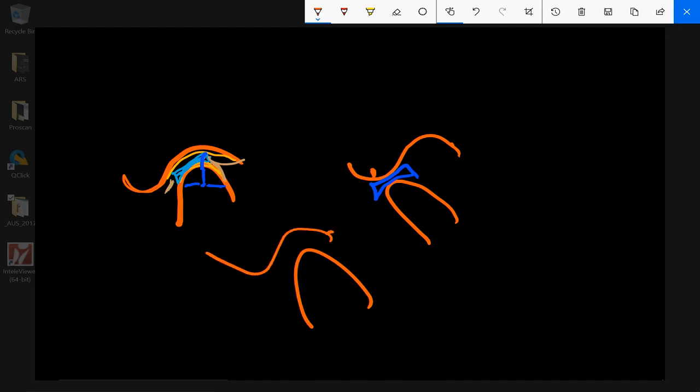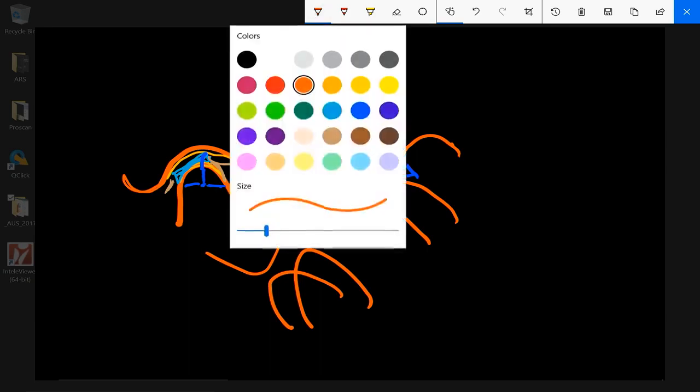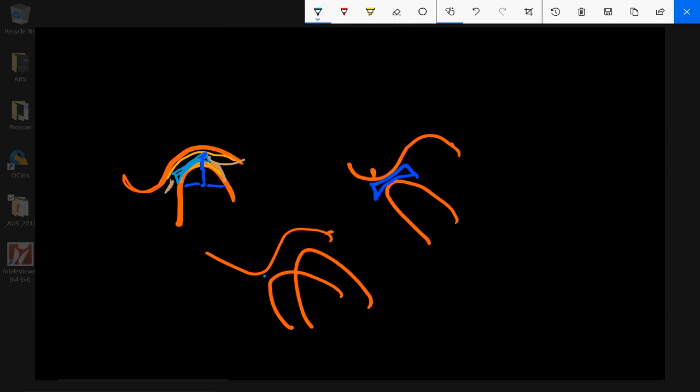Patient has opened their mouth, and now the condyle moves forward. And where's the meniscus? The meniscus is scrunched up over here like a little S. That would be absence of meniscal capture.